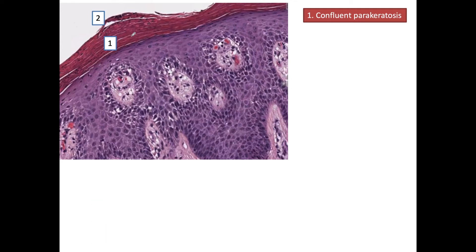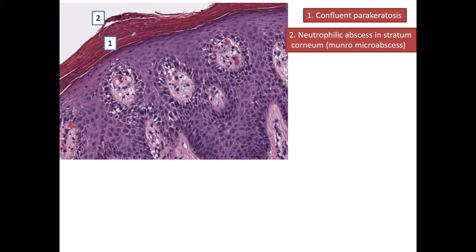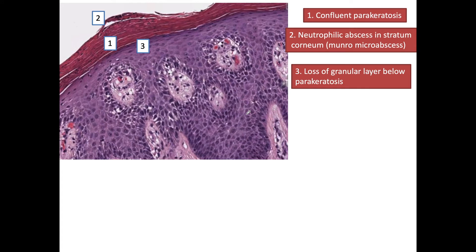The next feature is neutrophilic abscess in the stratum corneum — we can see neutrophils forming an abscess in the stratum corneum, which is called Munro microabscess. Micro abscesses can also be seen in the epidermis in the spinous layer, where they are called pustules of Kogoj. However, those micro abscesses are not seen in all cases of psoriasis.